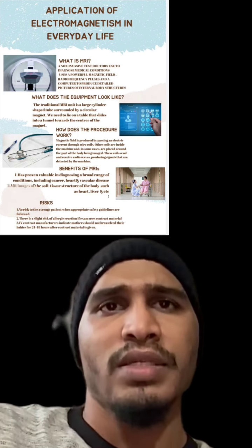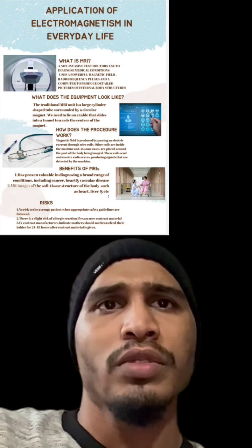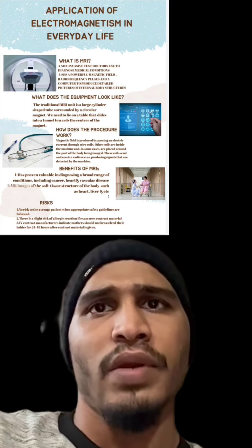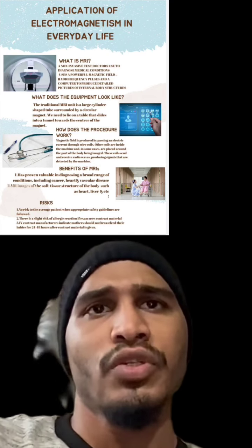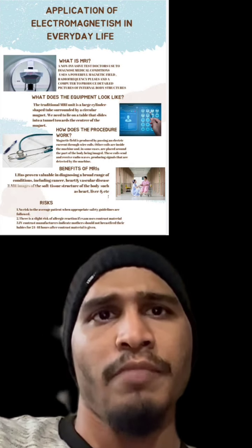When having an MRI scan, the following should be taken into consideration. People with implants, particularly those containing iron, should not enter an MRI machine. Noise: loud noise, commonly referred to as clicking and beeping, with sound intensity up to 120 decibels in certain MRI scanners, may require special ear protection. Nerve stimulation: a twitching sensation sometimes results from the rapidly switched fields in the MRI.